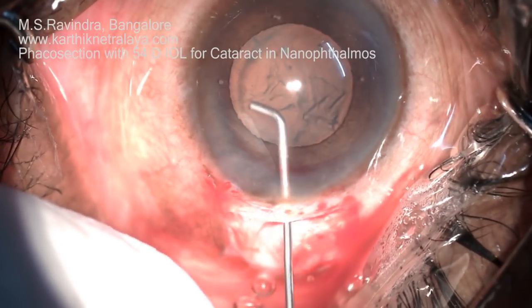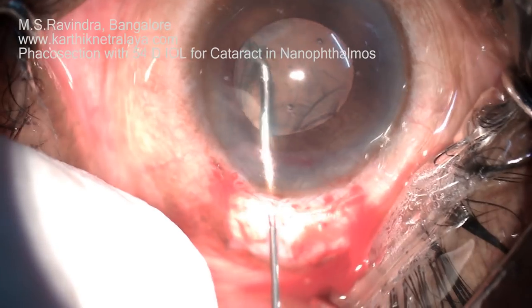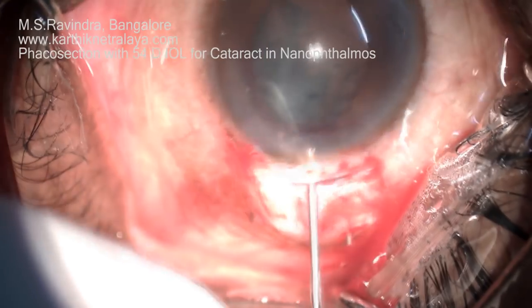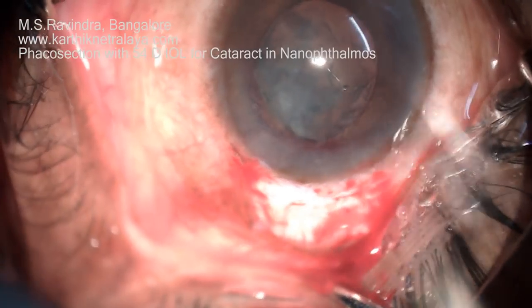Hydrodissection is being performed — capsular separating hydrodissection really helps in removing the bulk of the nucleus and epinucleus.